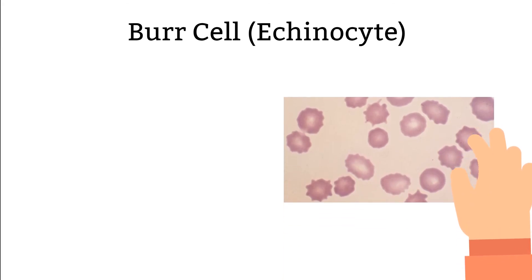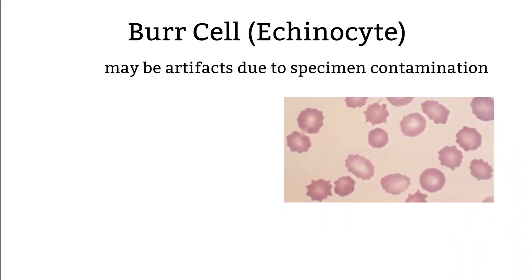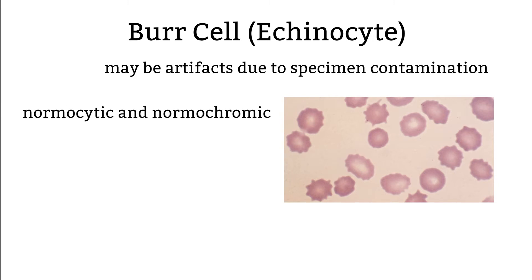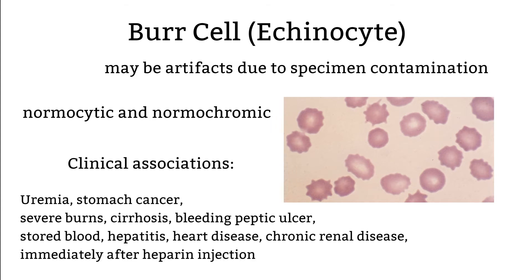Burr cells. Usually we only see a small number of burr cells, but if you find them in large numbers, they are usually artifacts due to specimen contamination. This type of cell is usually normocytic and normochromic. The shape could be caused by depletion of ATP, exposure to hypotonic solutions, and specimen contamination. Here are some diseases associated with this type of morphology.